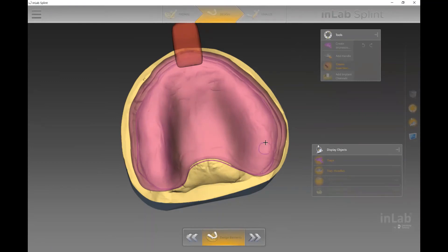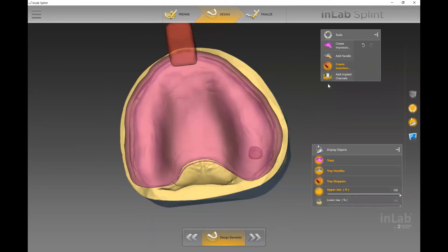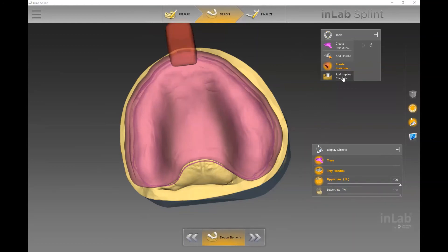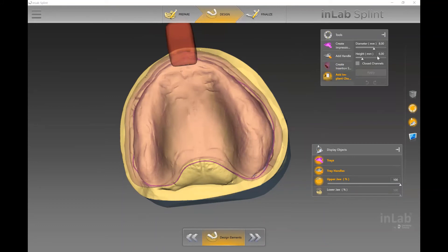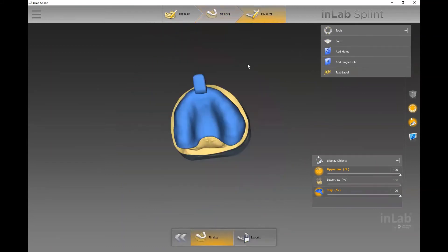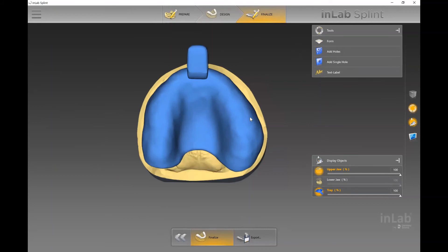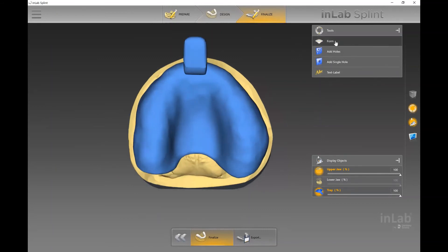The next option is 'Create Insertion Stop,' which is a tissue stopper. To place one, you draw your margin by double-clicking with your left button for single clicks to tag the line and help curve it, then double-click to finish. You're always able to add those insertion stops or tissue stoppers. For implant channels, you can control the diameter and height of the channel and make it a closed or open tray — it defaults to open tray, but you can make it closed.